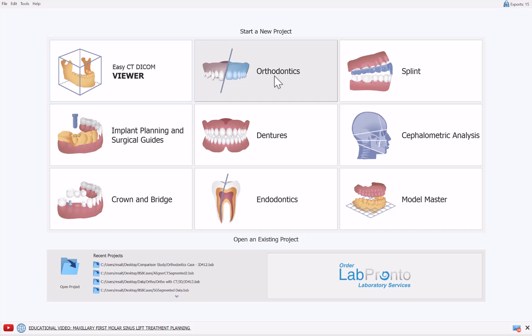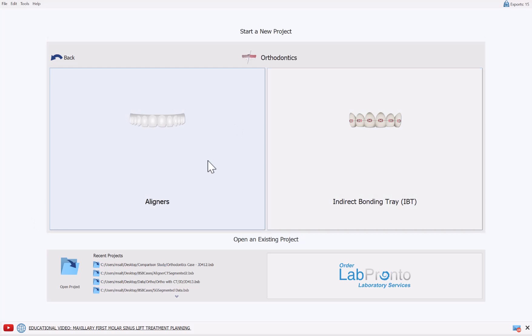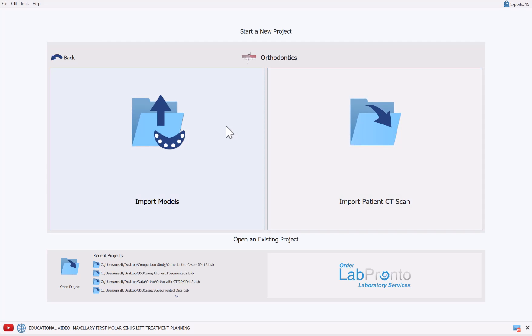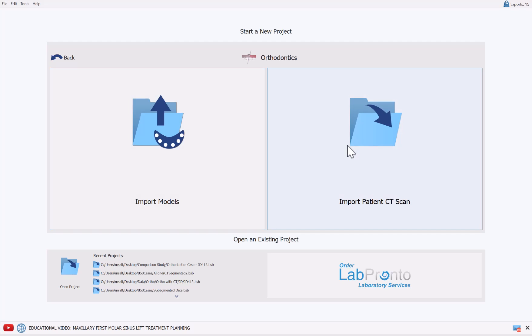When clicking on orthodontics and choosing aligners, we can see that there are two options for two different process flows. There's the option to import models, which we could call the traditional way of planning a digital aligner case for aligner fabrication, and then we have the import patient CT scan option.